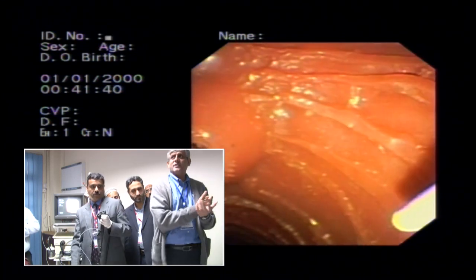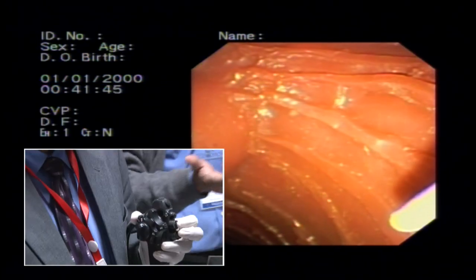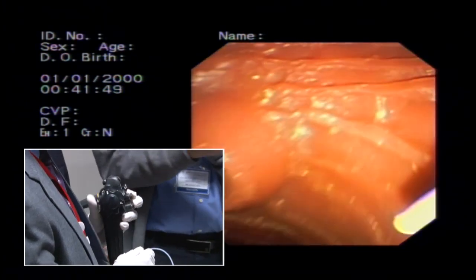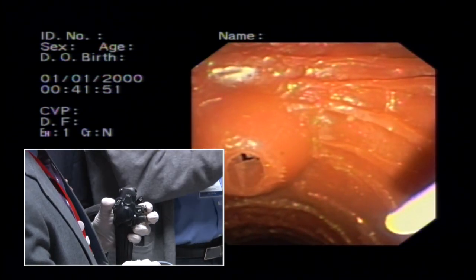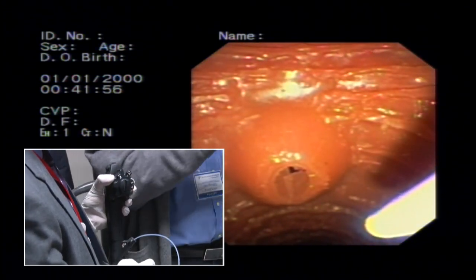You will see the ERCP guys, all of them, are quite often doing this. In fact, a lot of endoscopy, not only ERCP. In ERCP, because your position is like this, quite often you will see the person move a little, talk, then go back to the same position, you understand what's happening.